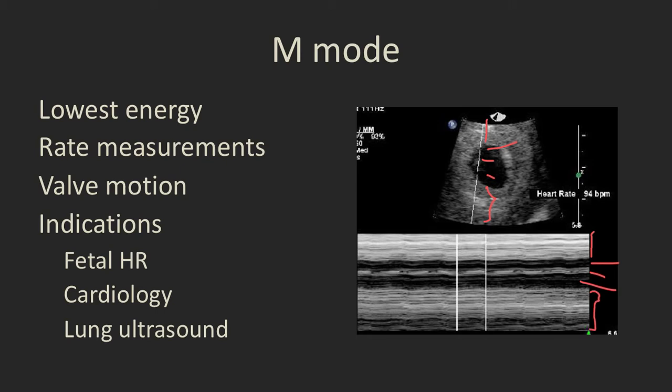How do we measure the embryonic heart rate? If you look very closely here in the bit that displays the embryo, you'll see there's constant little blips, and that is the moving of the cardiac tube. We measure the distance between them which can then be converted into a heart rate.